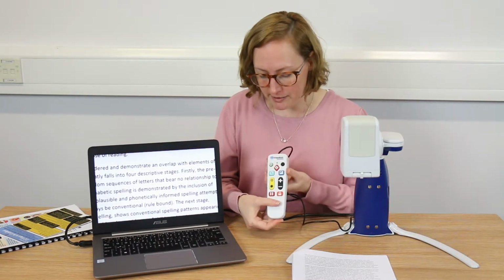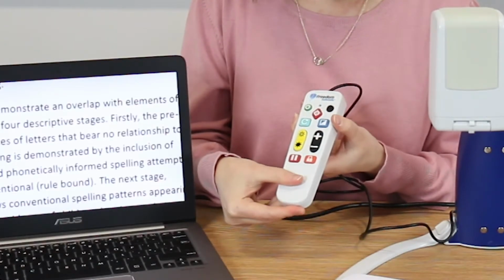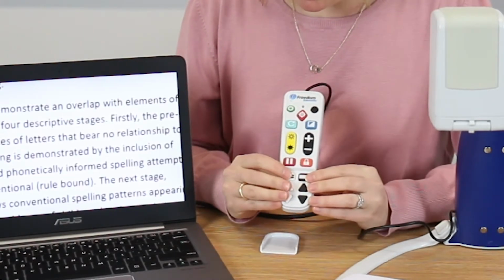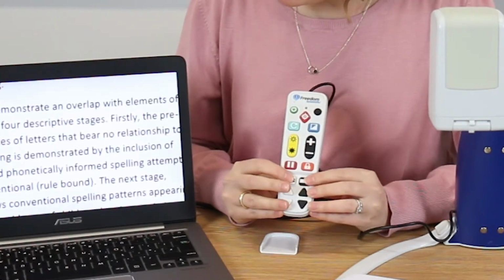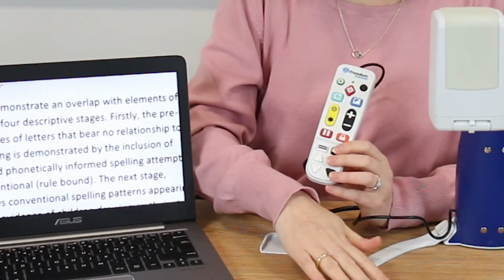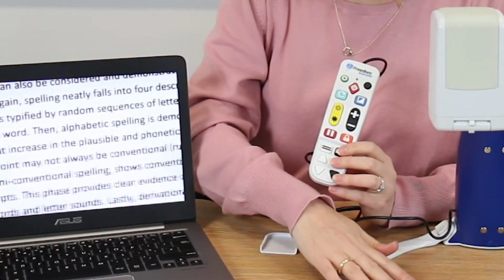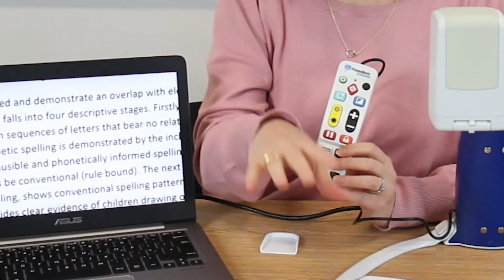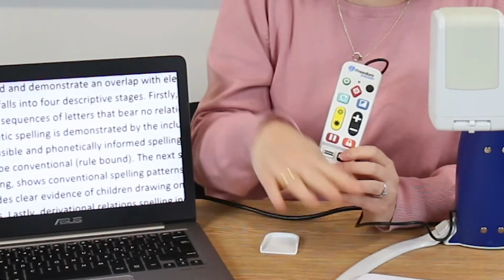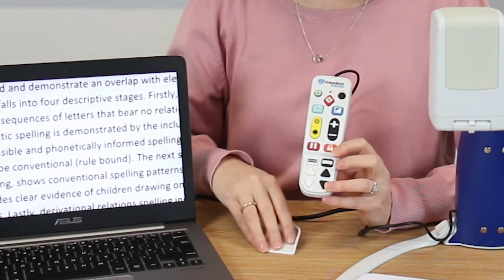We also have a few buttons hidden underneath the little cover there, and they're hidden just so that they're not knocked by mistake. And these add in things like reading lines and reading curtains. So what the reading lines do is enable you to put a line across the screen. Because you're using the page or moving the page when reading left to right, the reading lines enable you to stay on the right line and then easily navigate to the next line. And the curtains do exactly the same thing, but instead block off the screen for you.